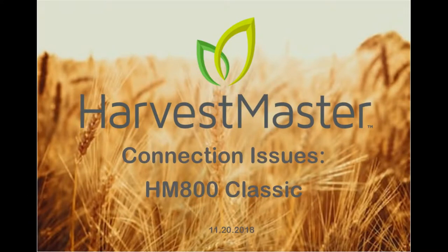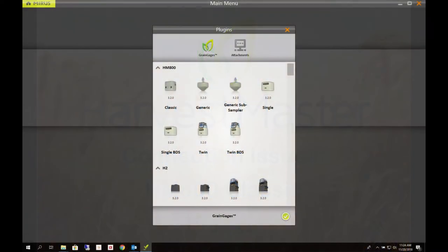We will review some simple options for diagnosing a connection issue. First, make sure you are using the correct plug-in.